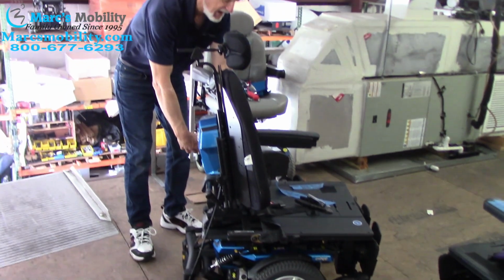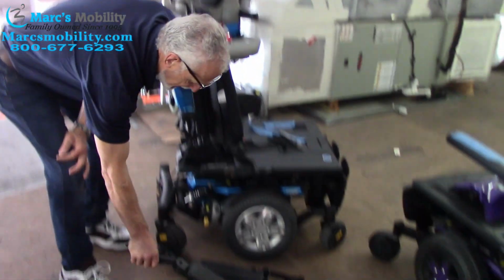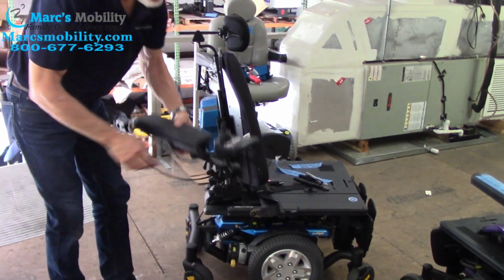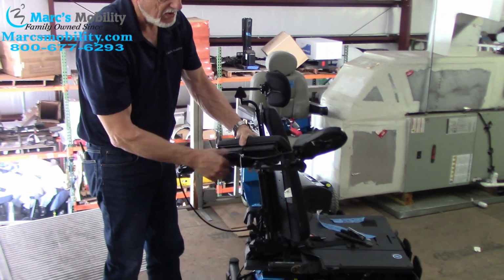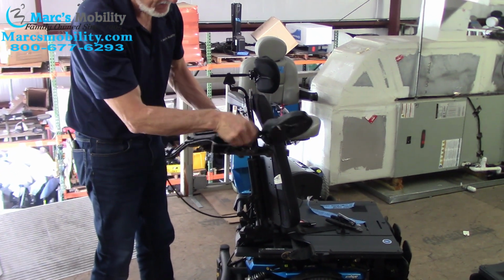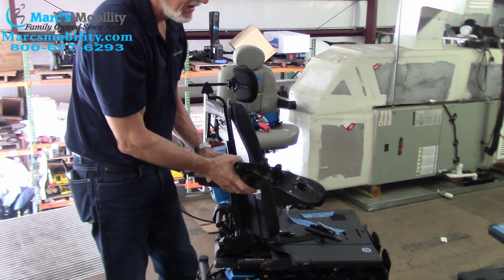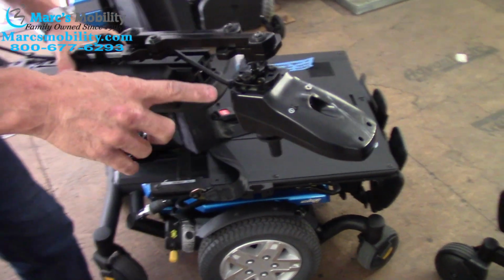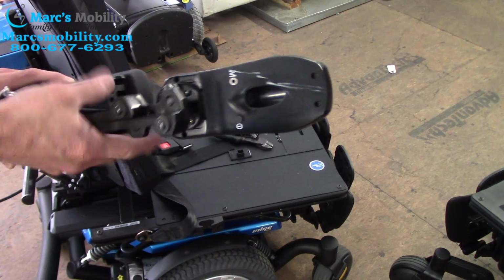You'll take the other side out, okay? And I'm going to set, then what you're going to do, you're going to take the joystick off of this arm, because I'm going to send you another arm. You need to keep your joystick and your cable, of course, okay? So right below this joystick, if you look over here, and I'll send you the tool, there's a little screw right there, a bolt on both sides, okay?